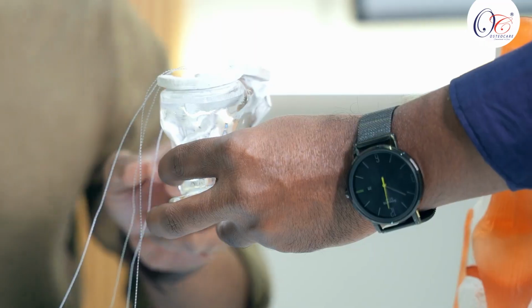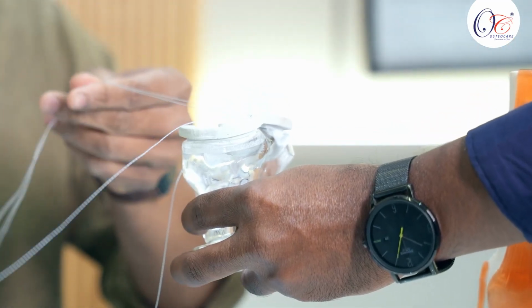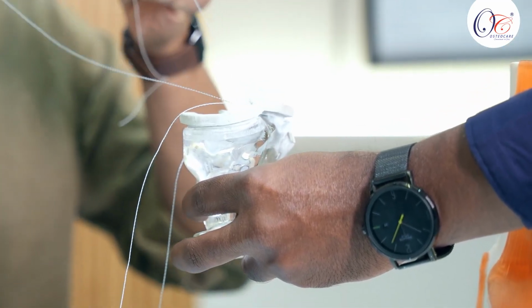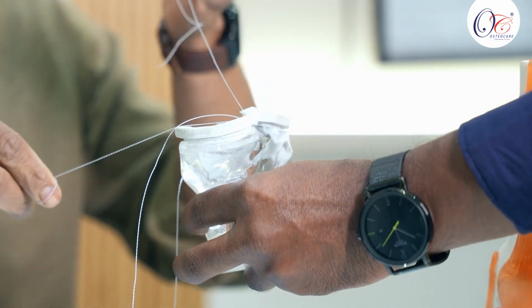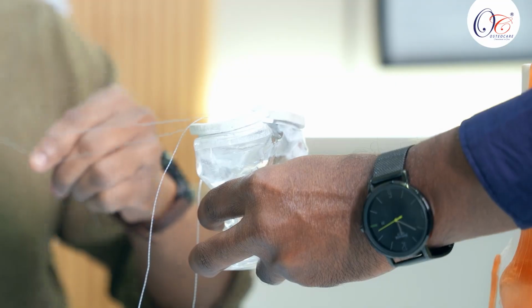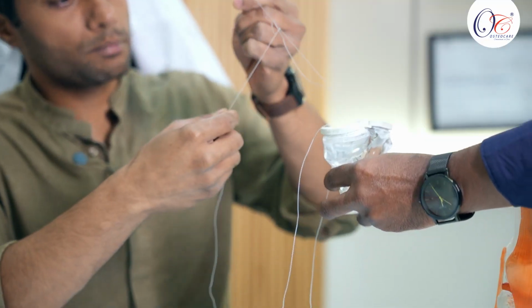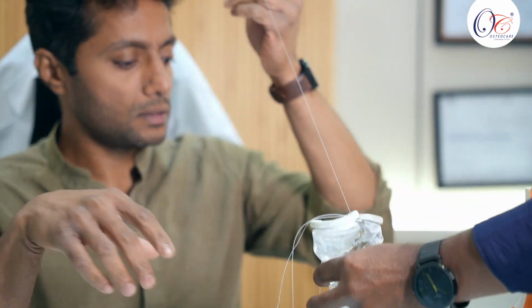Okay. So once all these are here, all we have to do is tie arthroscopic knots, because it's not open like this in the surgery. So during surgery, we have to use these to tie knots through the cannula. So there are specific instruments for this.